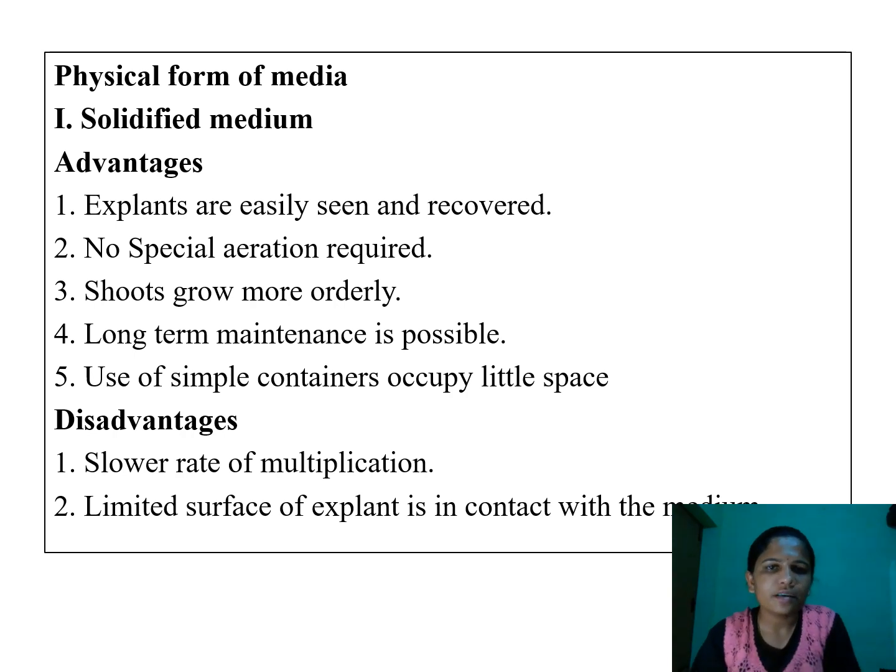So we will see which are the different types of mediums or media. Normally, solidified media, as the name itself indicates, will be in a solid form. And what is the advantage of using this particular solid medium?